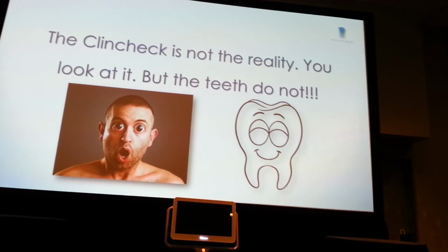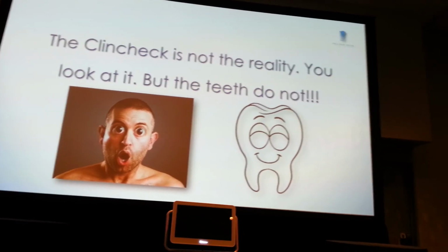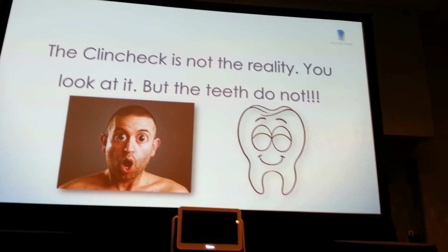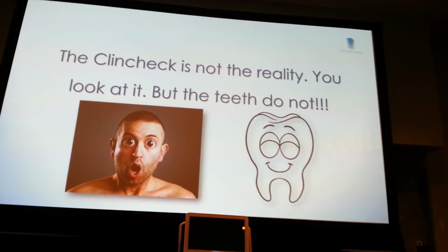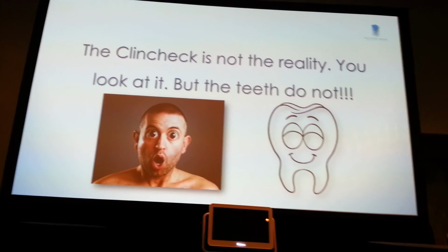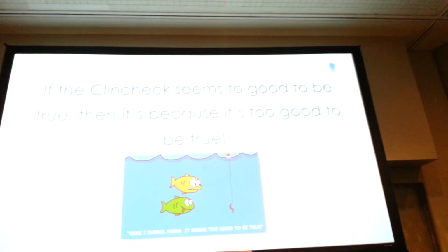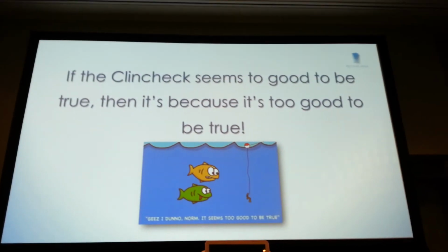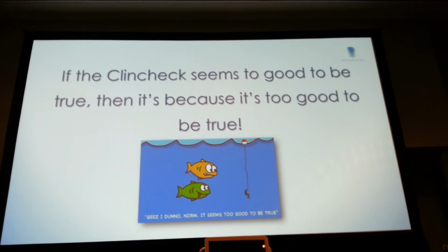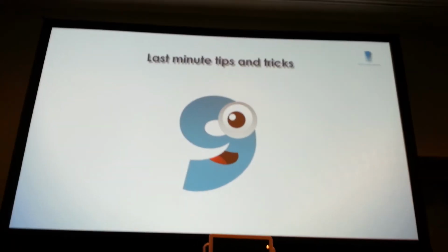Number 7. The ClinCheck is not the reality. I hope you will remember this. You look at it, but the teeth do not. Again, you are in the real world. This is the virtual world. Same thing as your technician. If the ClinCheck seems too good to be true, usually it's because it's too good to be true. Like a lot of things in life.